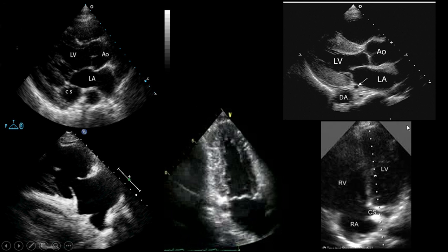And about this kind of anomaly, I am going to talk in part 2 of the bubble test study in detail.